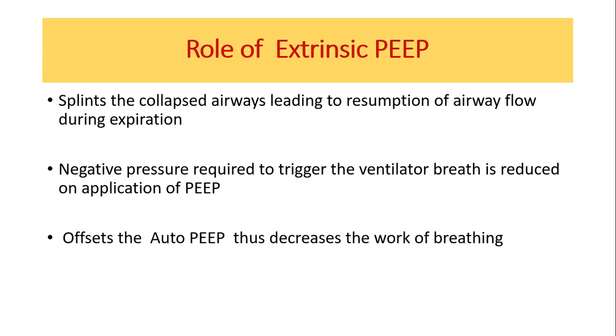So when is it useful now? Is it useful when I have intubated the patient and put on the ventilator? Or is it useful when I am trying to get the patient to breathe by himself and wean the patient? Yes. Now you understand why it is important during weaning. That is a phase where it is actually important.